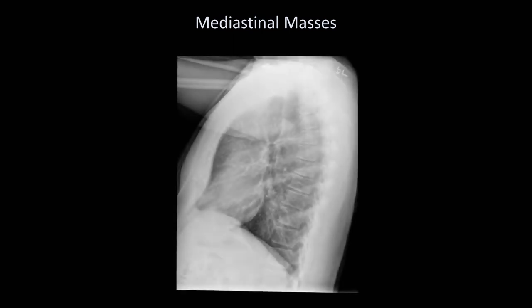To best understand mediastinal masses, which are responsible for truly widened mediastinums, one must be familiar with the 4 regions of the mediastinum. These regions are not precisely defined by any actual tissue planes, and their definition varies slightly between sources, but this is approximately where the divisions lie.